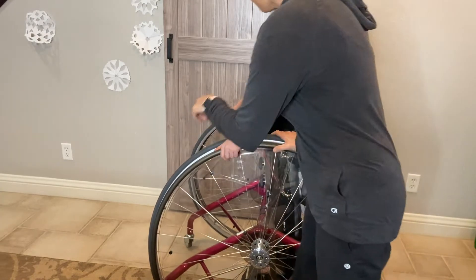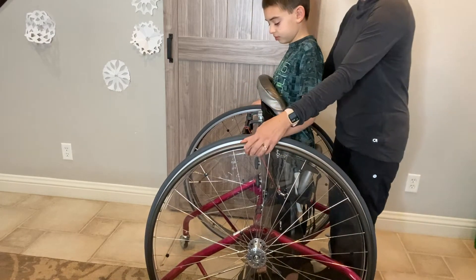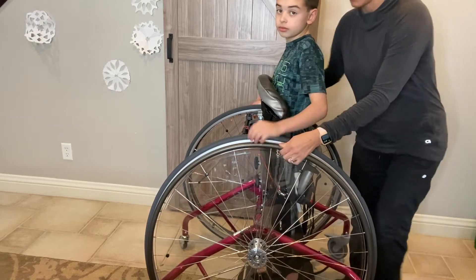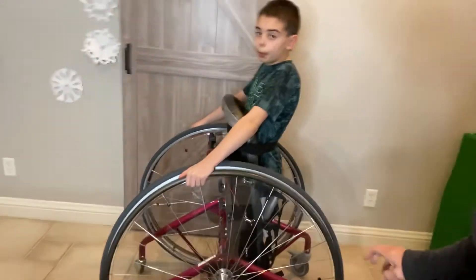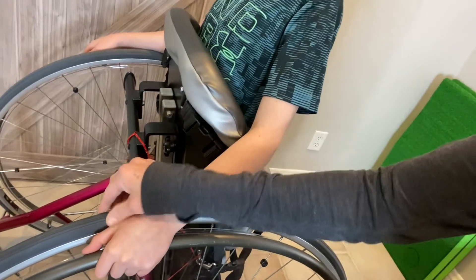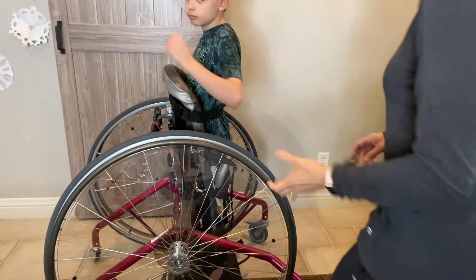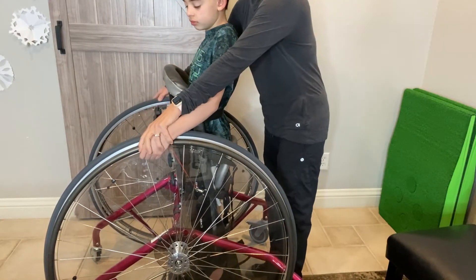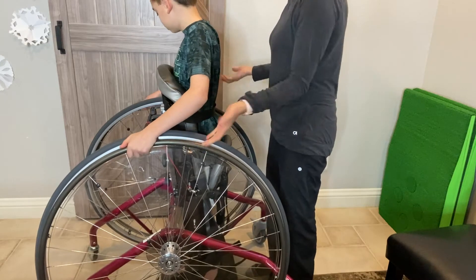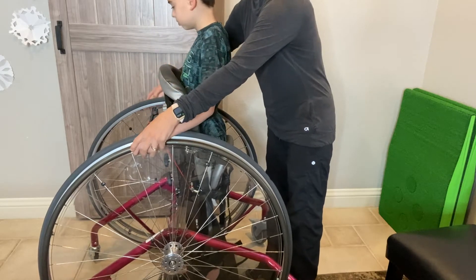Make sure all of the little foot brakes on the back wheels are unlocked. A lot of kids really cannot reach out this wide to the rim, but we are going to prompt them to use the rims on the mobile stander because it will be easier for them to mobilize using the rim and it's not quite as dirty. Most kids, though, will start to use the tire because it's just easier and they can grip it better. Sometimes you can get some nice wheelchair gloves for this activity so the kids don't get their hands all cruddy.